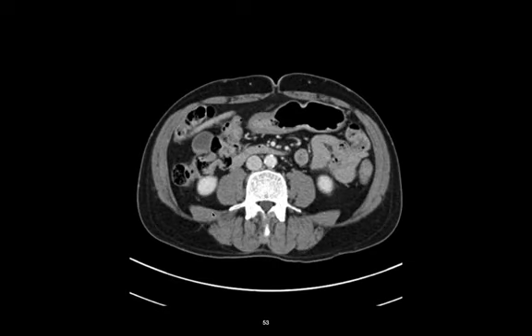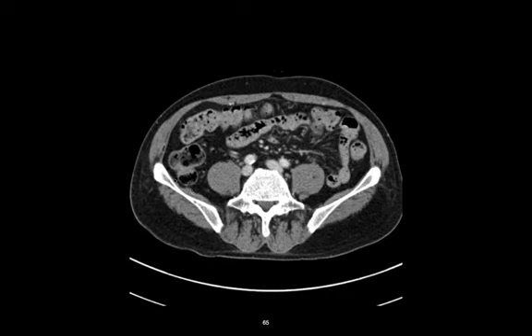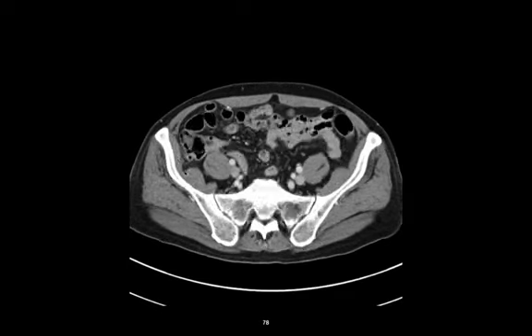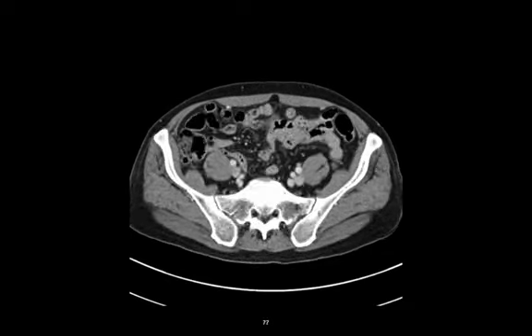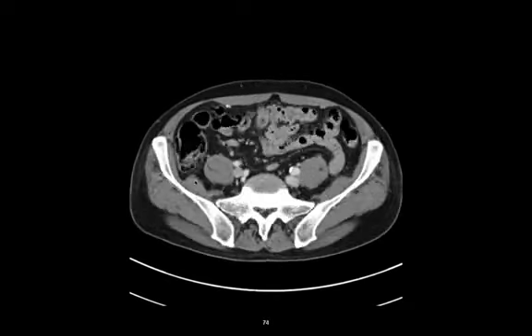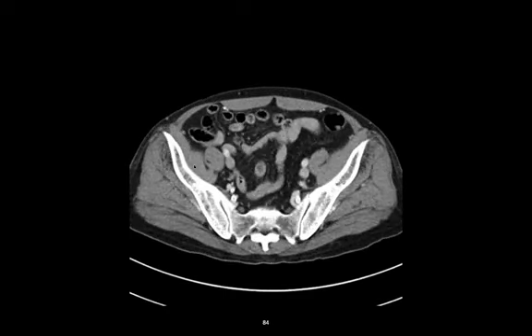Okay, and then our iliacus. To see the iliacus, we find the iliac bone, and in the iliac fossa right here, there's our iliacus. And the other thing I can tell with the iliacus is it's going to then form wonder twin powers with our psoas. So we follow the psoas down. You see it getting closer to the iliacus. Once they go under the inguinal ligament, these two become the ilio-psoas musculature, the big hip flexors for us.